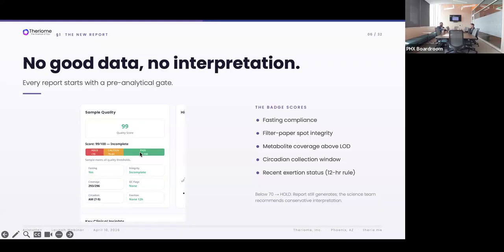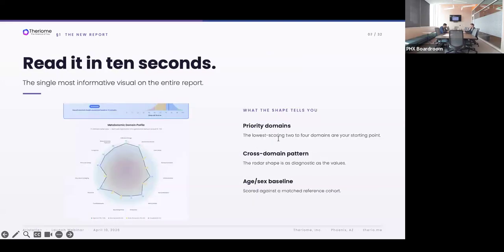One thing I should note is that this makes it all the more important to convey to your patients to follow the kit instructions. Okay. I know it is a finger prick dry blood spot collection. It seems on the face of it like a very simple method, but the pre-analytical controls that we have with regard to sampling and fasting should be adhered to even more now.